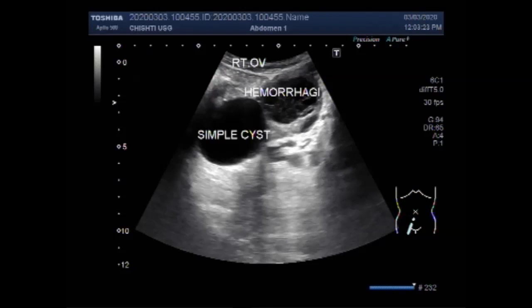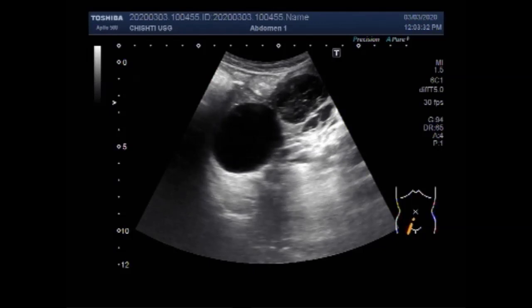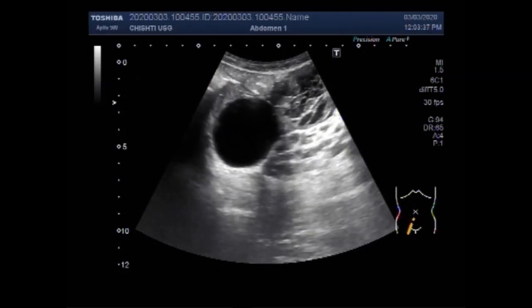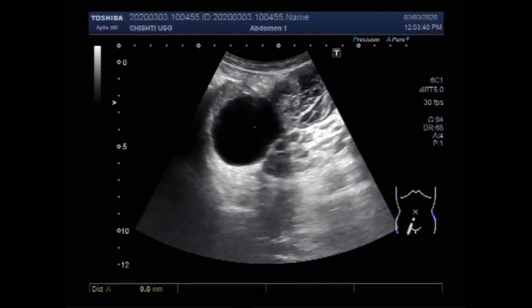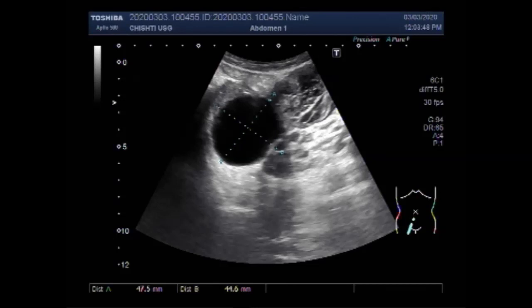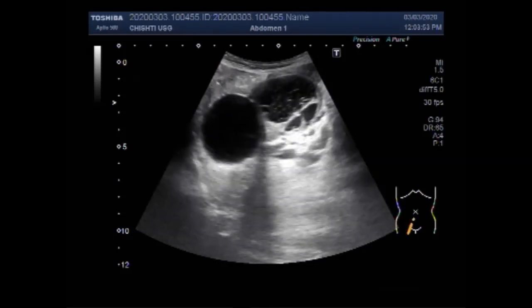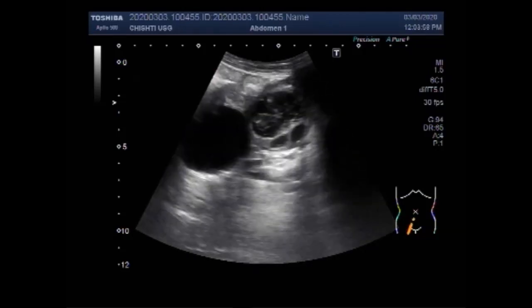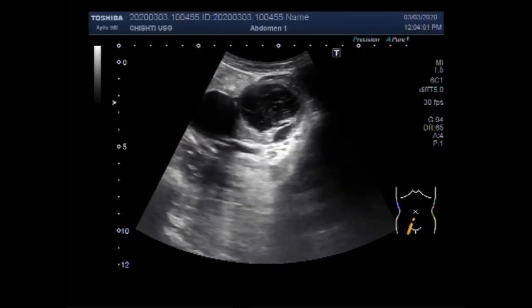You can see the difference: the simple ovarian cyst has clear fluid with no significant internal turbidity, while the hemorrhagic ovarian cyst has a large amount of thick sludge due to bleeding that occurred in the cyst. Infection may also cause internal turbidity in the fluid seen in ovarian cysts.